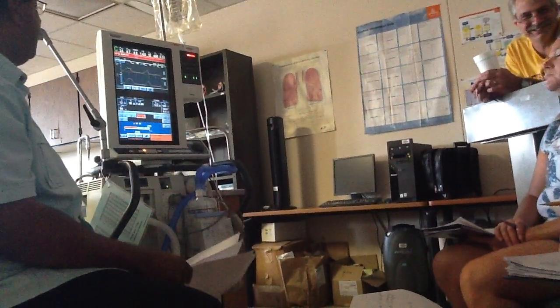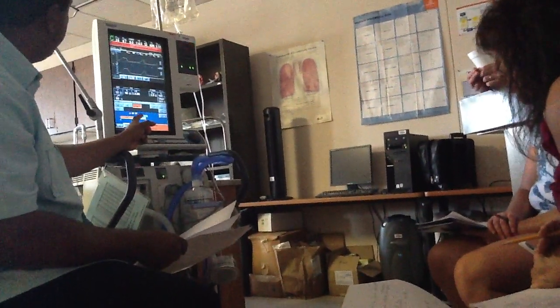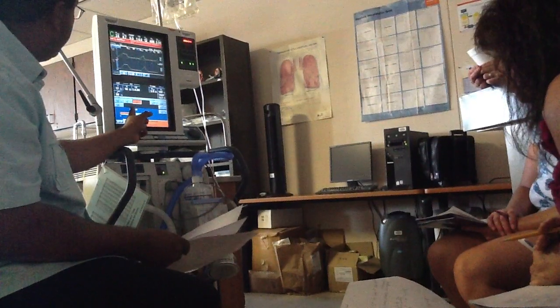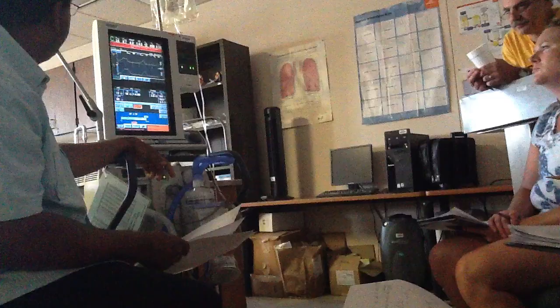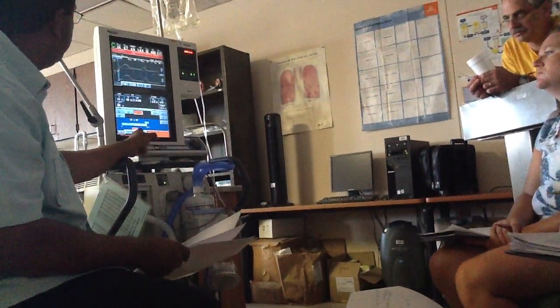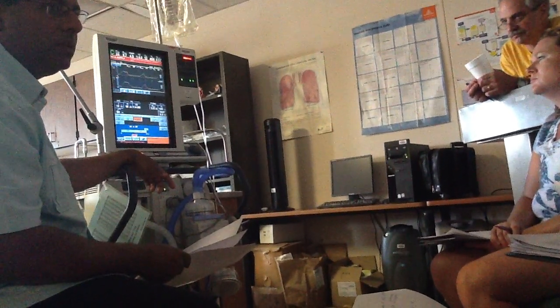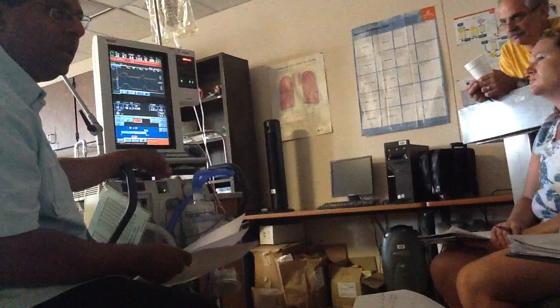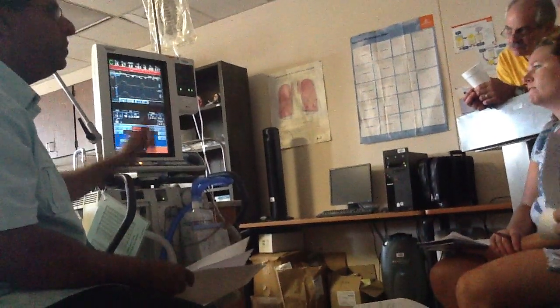Okay, here we go, there you go. Now lock it. Push the button in the middle. Right now, an I to E ratio of 1 to 1 is locked. You're not actually locking the TI, you are locking what? Your IE. So when I pushed it, it's 1 to 1.